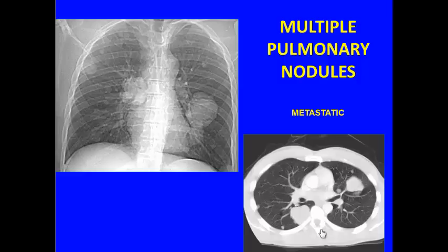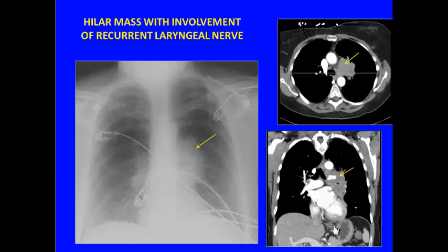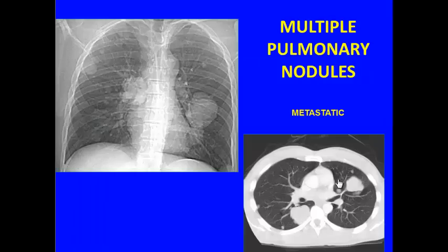The CT scan, able to see a little bit better, able to see the lungs. We're able to better characterize findings in the lungs with the CT scan, looking at images with the lung windows, and we can look at it with also soft tissue windows. So here we're seeing this large mass in the AP window or in the left hilum impinging on the recurrent laryngeal nerve. So looking at that mass, we can certainly get a better approximation of its size.